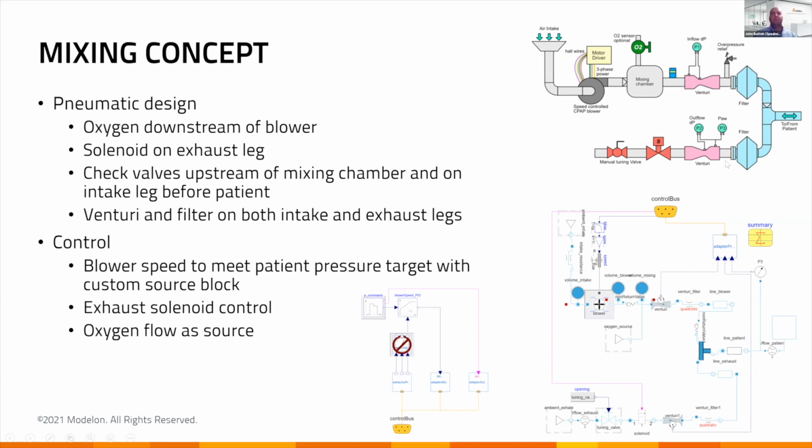There's a couple of check valves in the system, and also more representative resistances with the Venturi sensor and also the filter. The control here was done with a custom block that can generate pressure commands based on the kind of inputs that the doctors would put into the device.